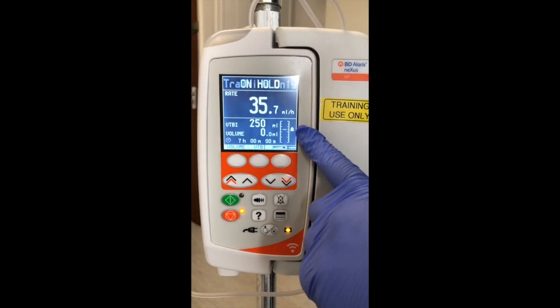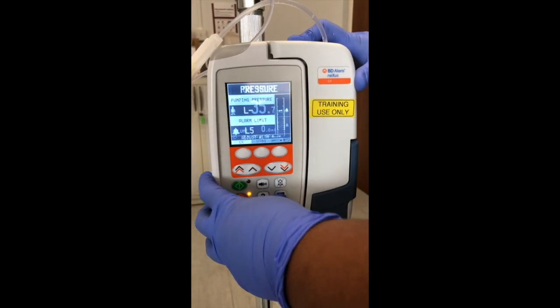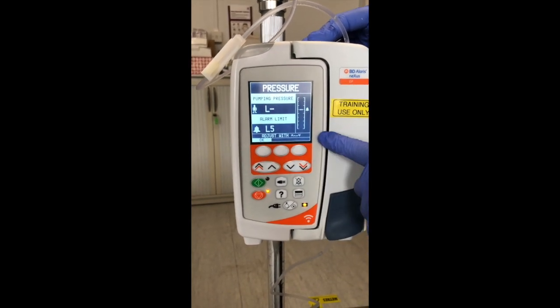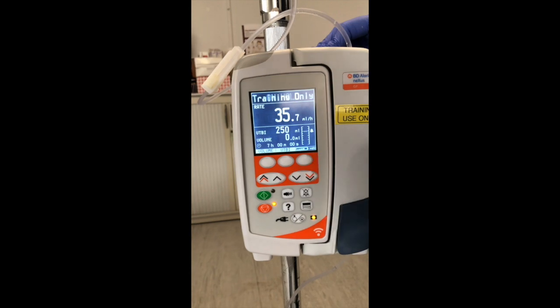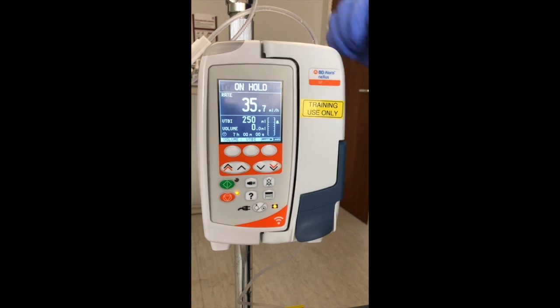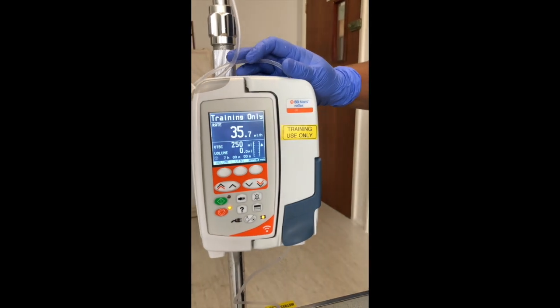Before starting our infusion, we need to make sure that we check the pressure setting. Again, press the pressure button and the default is set at level 5. So we're going to keep it at level 5, and if there's a pressure buildup up to 500 millimeters of mercury, it will trigger that alarm. If you find that your pump keeps alarming high pressure, you can change it by going one at a time and then seeing if the medication will go in. The things to take into consideration when doing this is the cannula size, the position of the cannula, is it positioned on a point of flexion, how fast the medication is going, the position of the pump in relation to your patient, as well as the viscosity of the medication being given.